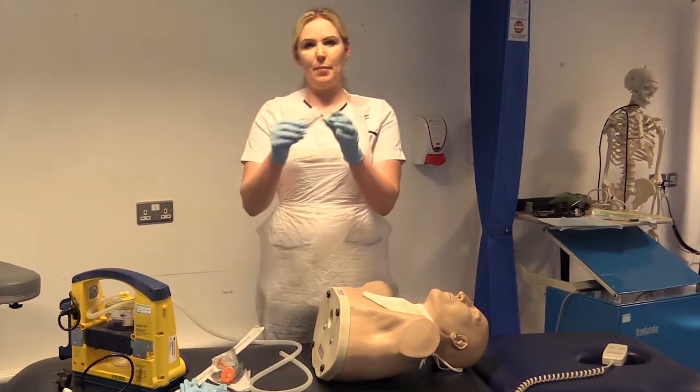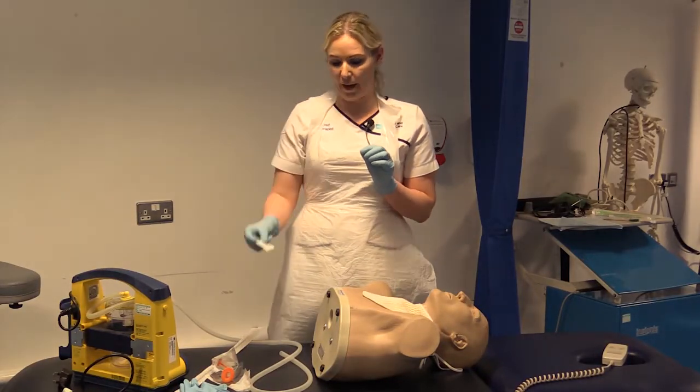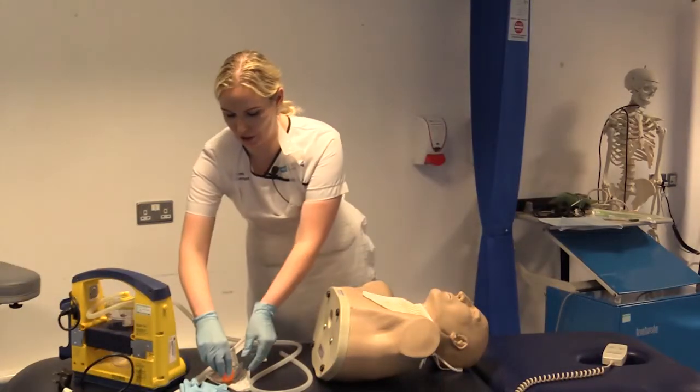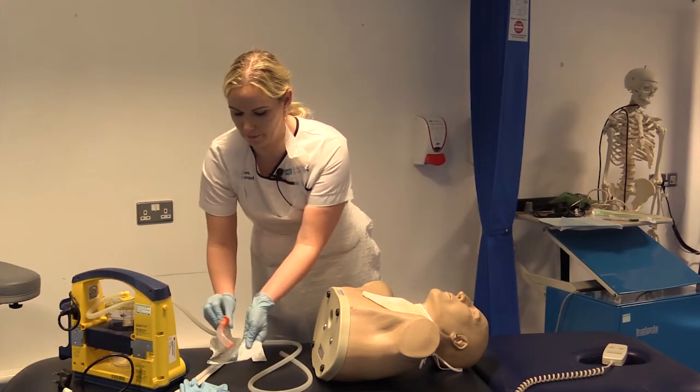And what we're going to do is apply a thin layer of gel on the inside of the packaging just to aid insertion of the airway. Okay, so at this point we're going to insert our airway. Again, just rubbing a thin layer of gel over our airway.